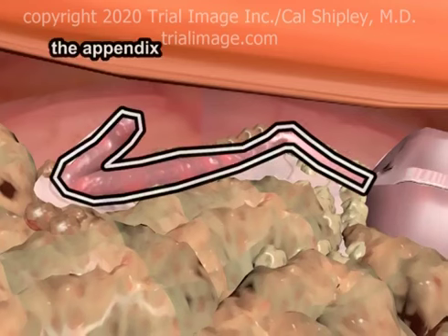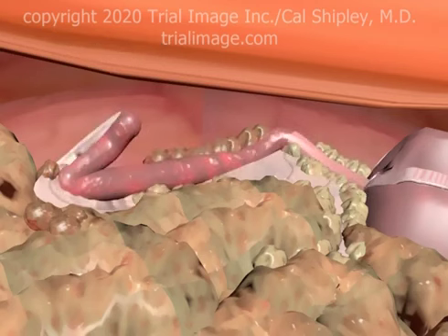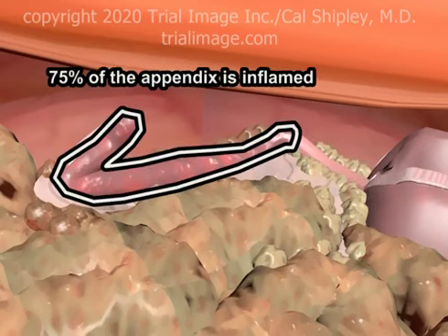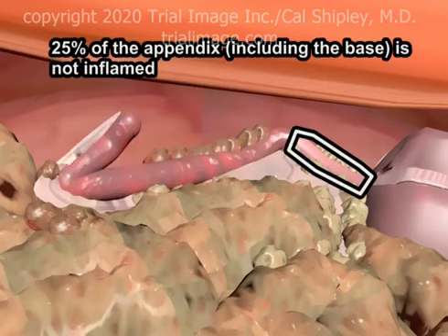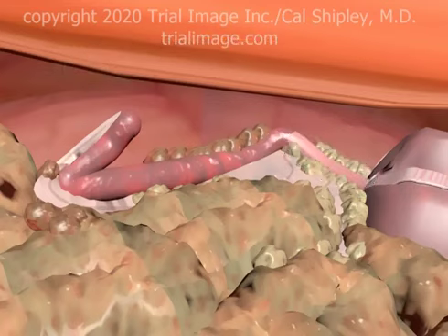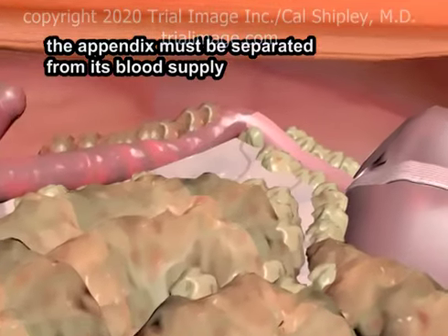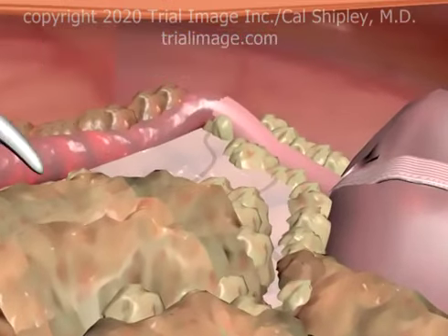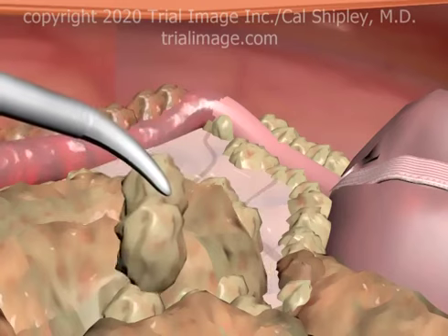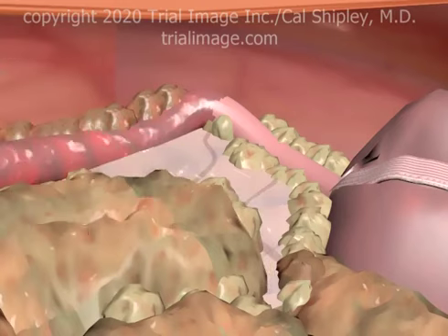At the completion of this dissection, the appendix can now be fully visualized. In this example, about 75% of the appendix has become infected and inflamed. About 25% of the organ, including the base, is normal. Having identified and exposed the appendix, the next step is to separate the appendix from its blood supply. In order to accomplish this, it is necessary to fully expose the mesoappendix, which carries the appendiceal artery and its tributaries.